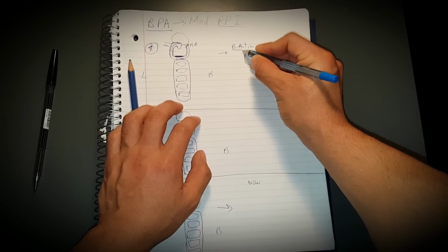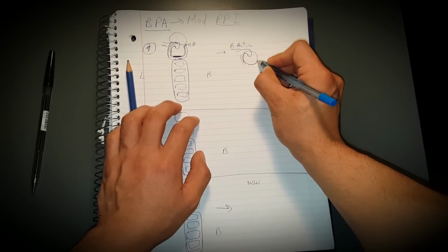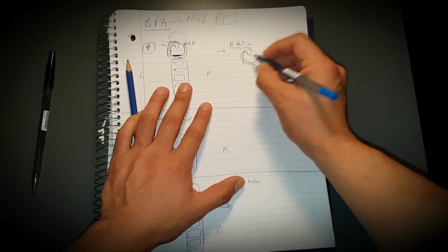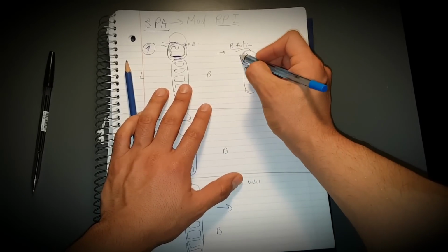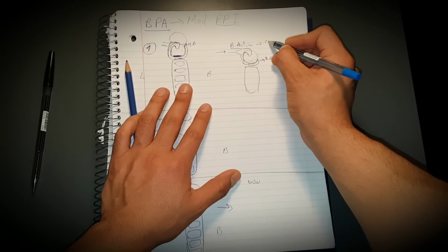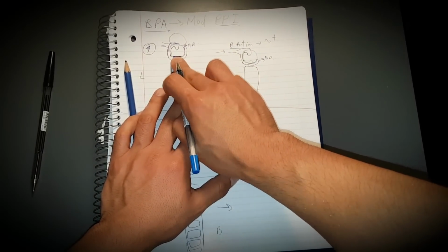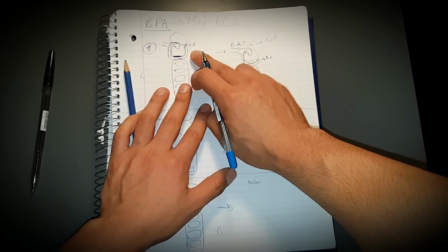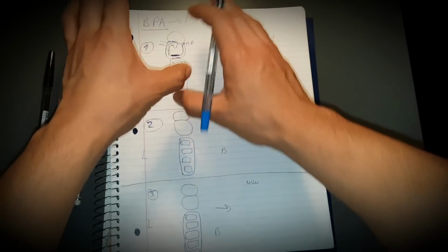It begins with the rest, comes all the way around the contour of the tooth and finishes here, so it engages the distal buccal undercut. And you know this is the saddle. So this is a back action. There is no guiding plane here. So it is just this, cast, and engages there. While this portion turns rigid into a proximal plate or a guiding plane, and then comes and engages the mesiobuccal undercut. So this is the first way to draw an RPA.